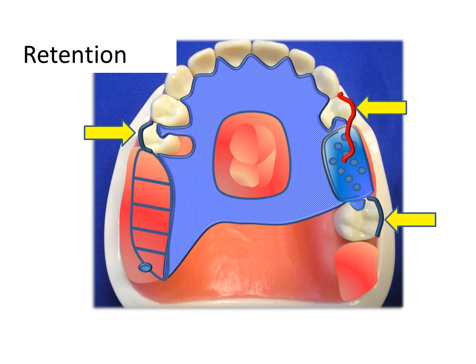Are there situations when we could not use the wrought wire? Well, in some cases there is simply inadequate space to solder a wrought wire. In other cases, sufficient undercut is not attainable.